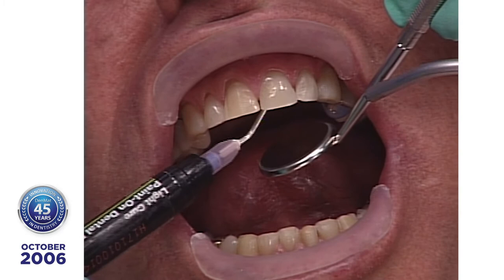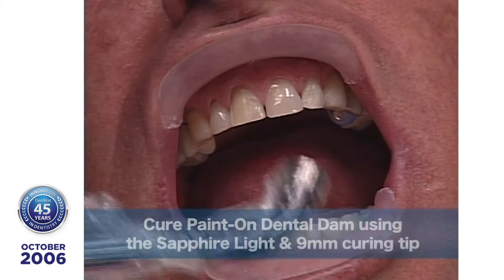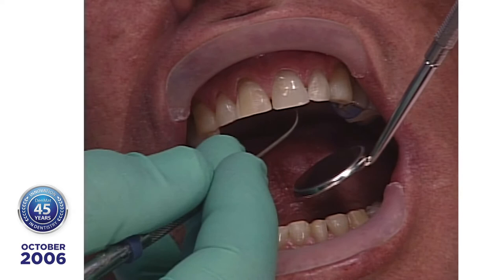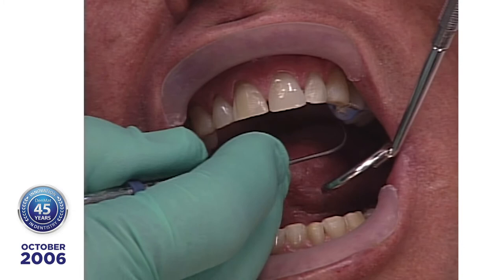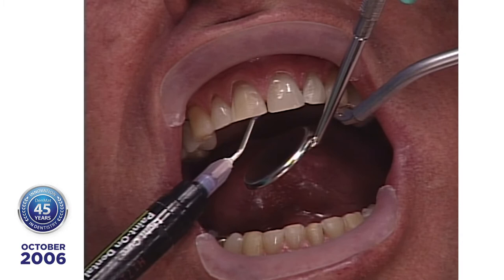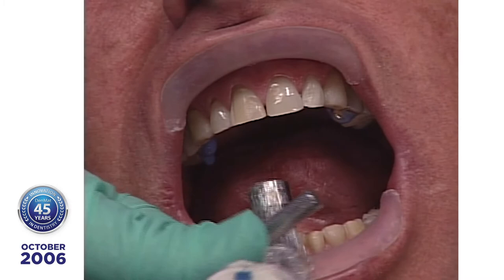Now what we're going to do is cure that for 3 seconds. Close your eyes. But the best way to protect your eyes is to close them. And then I want to check and see if I have partially polymerized the paint on dental dam to the rubbery state. Because every place I have the blue paint on dental dam, the Ultrabond won't bond to it. This is a real handy trick.